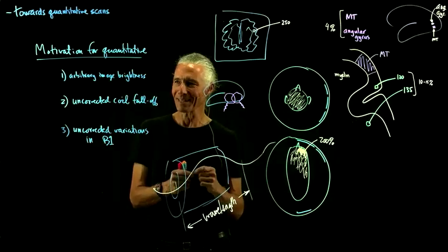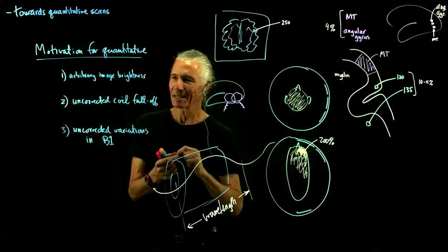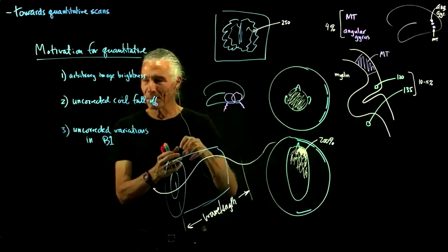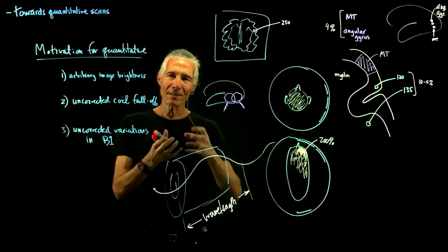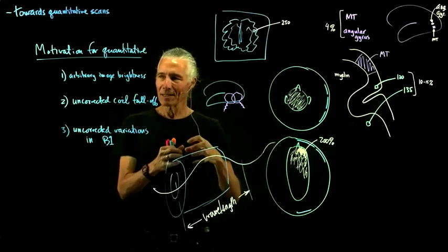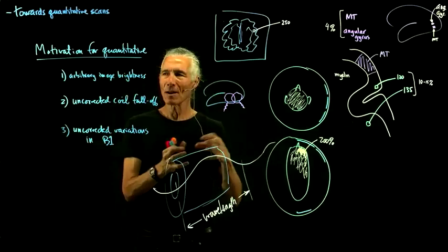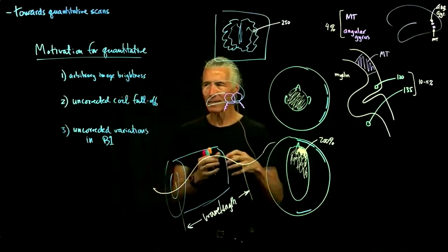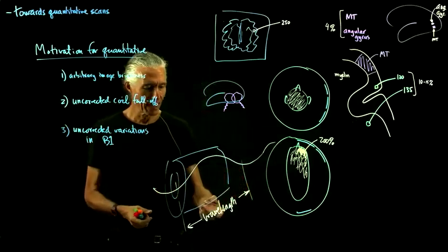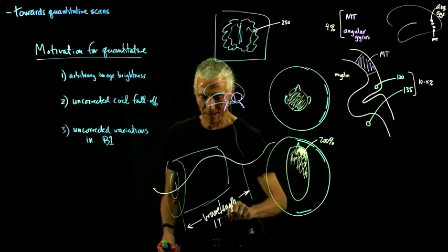So what happens in the microwave? You get hot spots. You stick something in there, something gets really hot, and something else isn't as hot. And what causes that? Well, the radio waves go in, and if they're about the same size as the actual object that you're stimulating, there's going to be a tendency for them to bounce around inside the object, like a resonant cavity. And this starts to happen already at 1 Tesla.